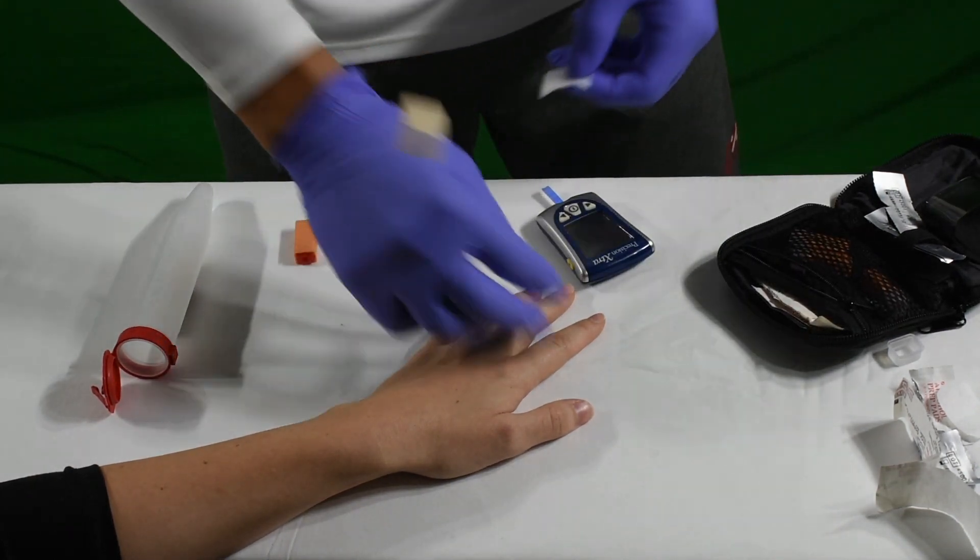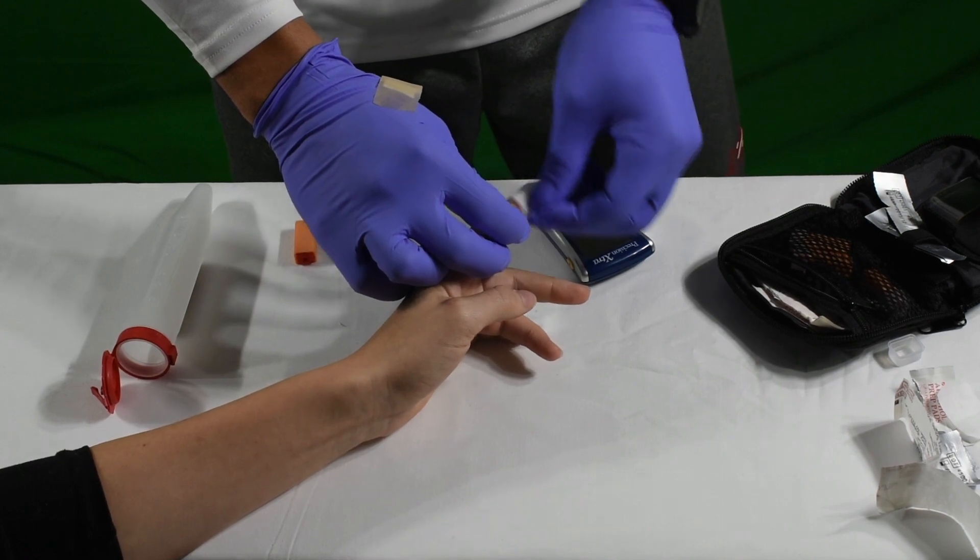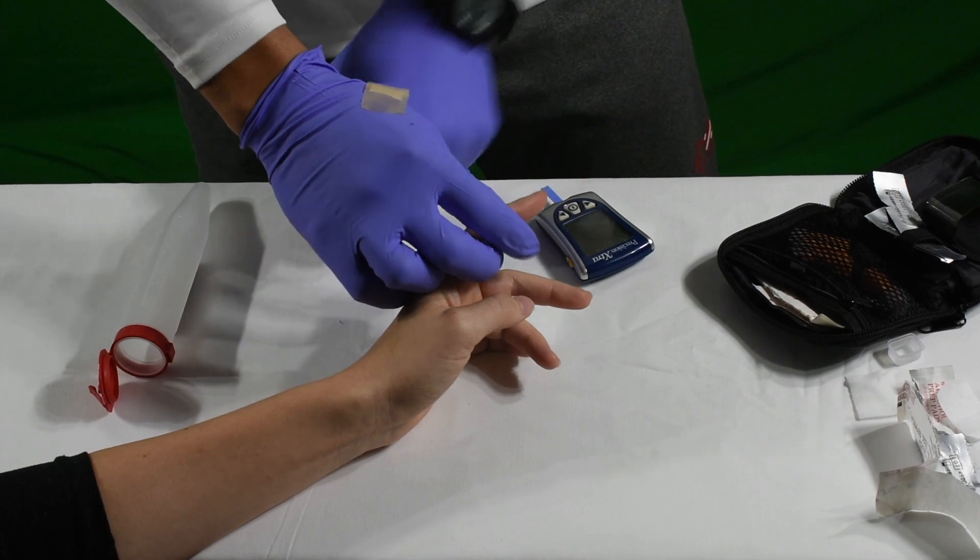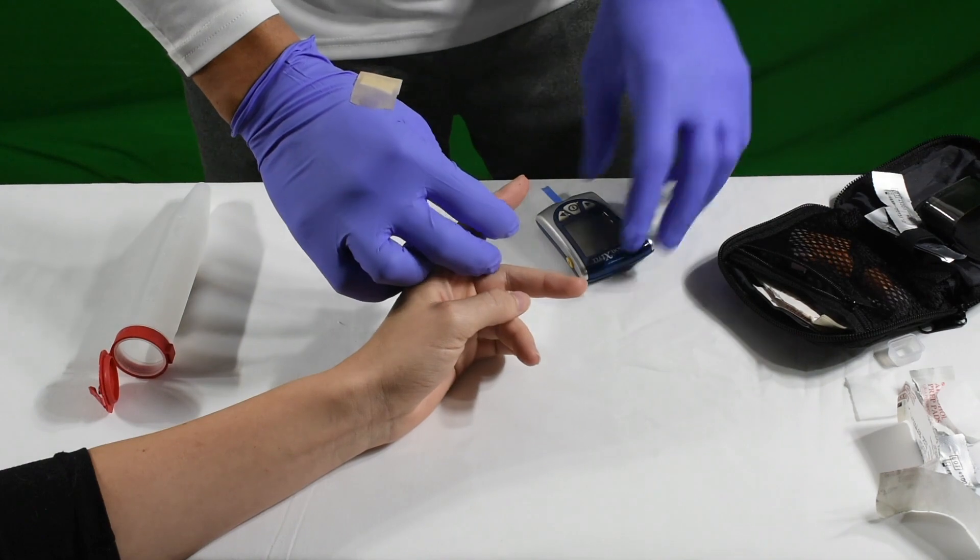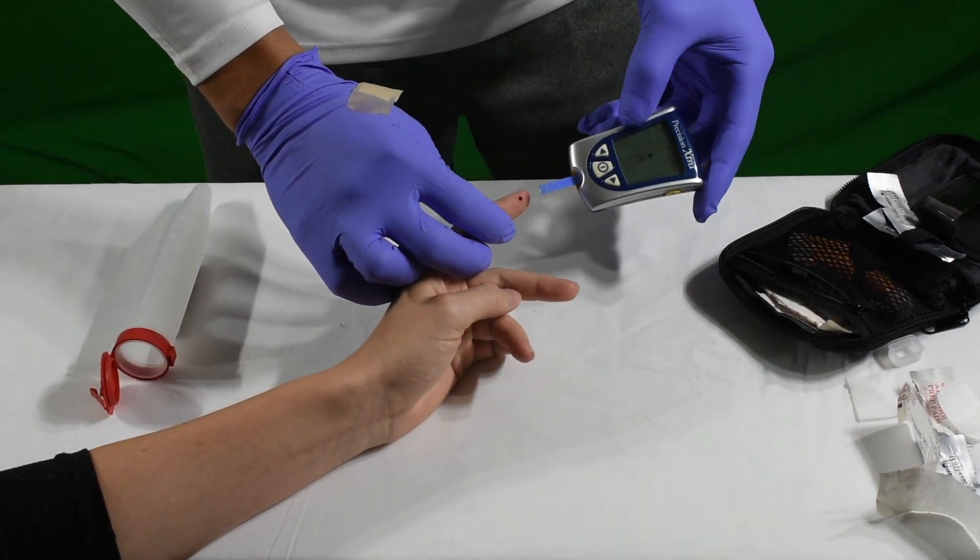What you want to do is clean the site. I'm going to use this finger here. It's going to be a quick poke. I'm going to apply pressure right here on the side. All done. Make sure the sharps are out of the way. Draw a little blood and then put the end of the test strip here.